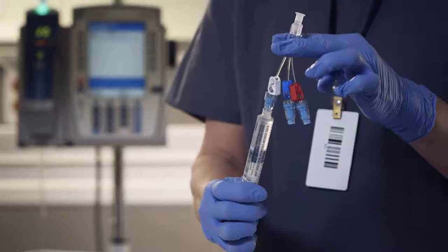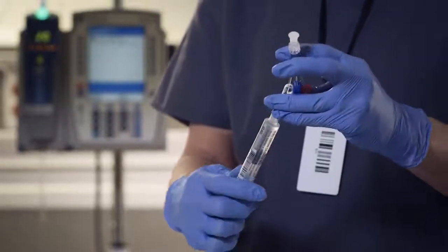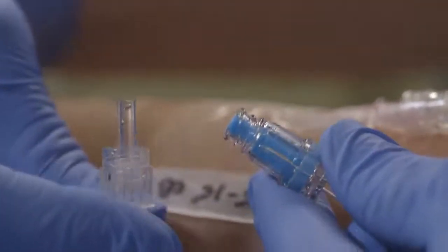For multi-fuse extension sets, remember to prime all leads of the set and invert to let air escape upward. Before attaching to the catheter, remove the vented cap.